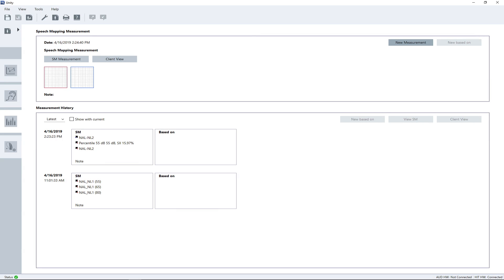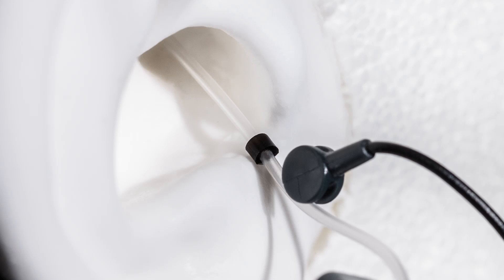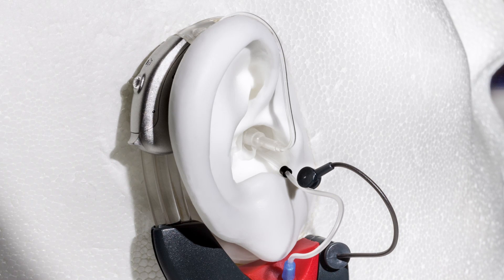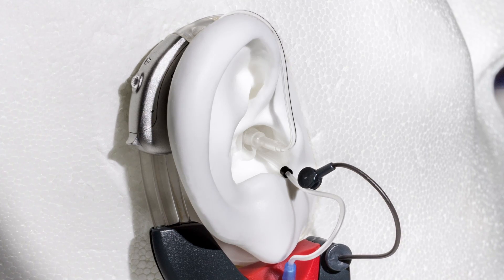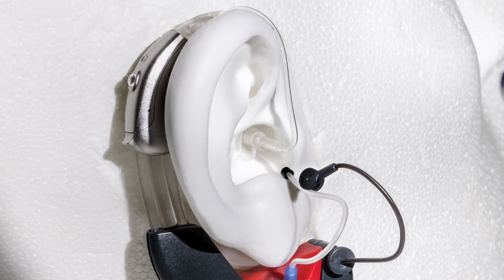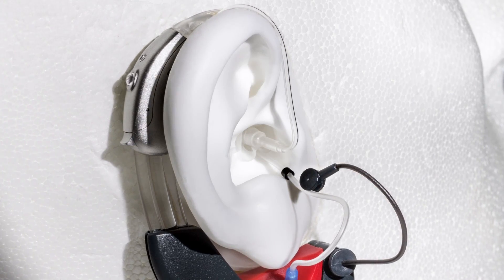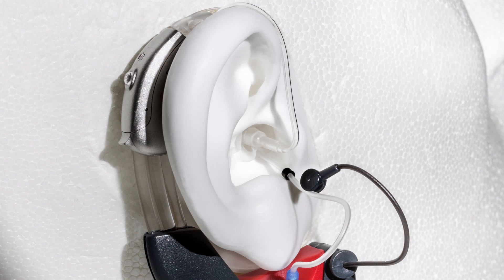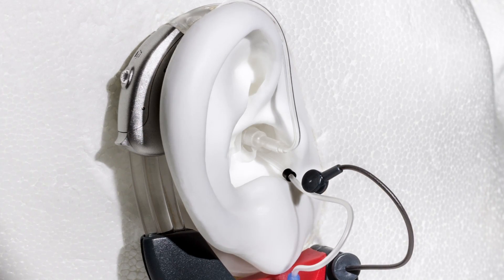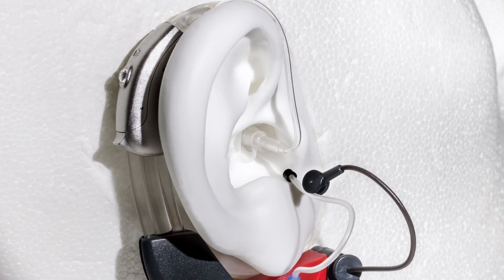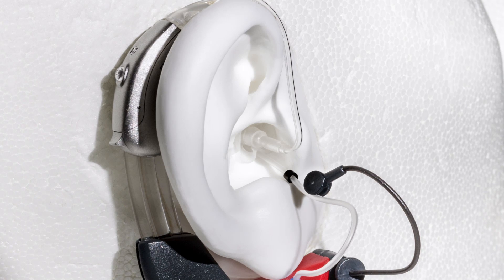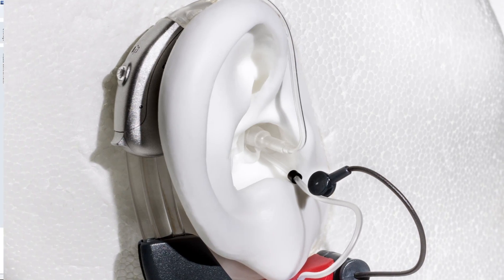Before you start the analysis, make sure the probe tube is properly inserted into the client's ear. Carefully insert the hearing aid into your client's ear canal while the probe tube is kept still in its place. For more detailed information, please have a look at our REM tutorial.